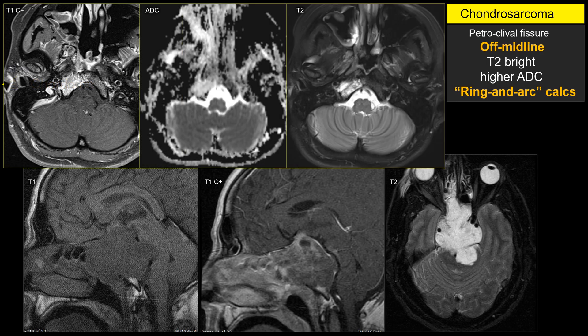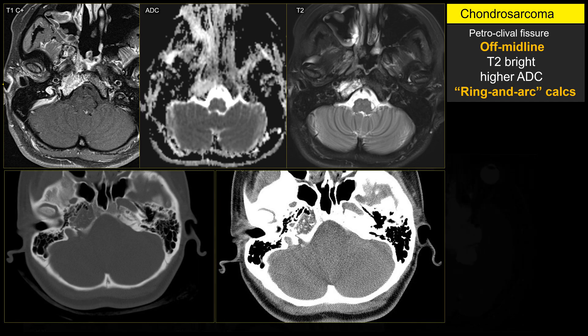An example of chondrosarcoma in a relatively young patient: on T1-weighted image you can see heterogeneous enhancement — in this case relatively avid. On T2-weighted sequence, notice that chondrosarcoma, just like chordoma, is relatively bright on T2. If you have CT, it is very helpful — you can see the classic ring-and-arc calcification, which is better for chondrosarcoma. So this case: eccentric, bright T2, ring-and-arc calcification — that is chondrosarcoma instead of chordoma.